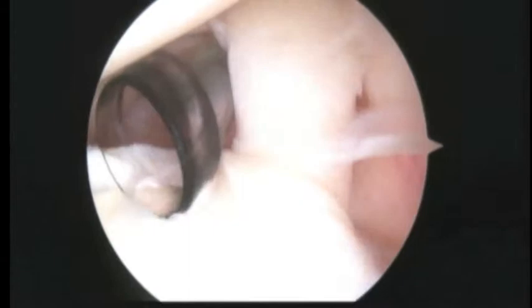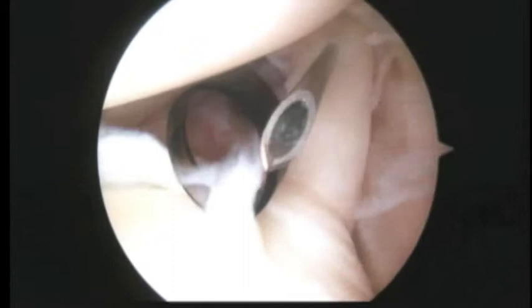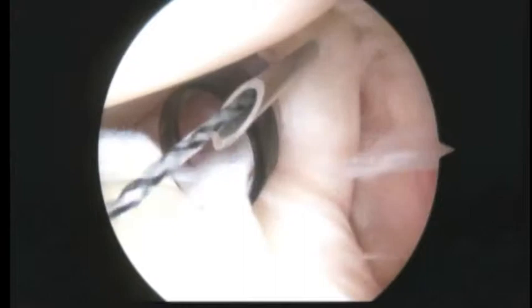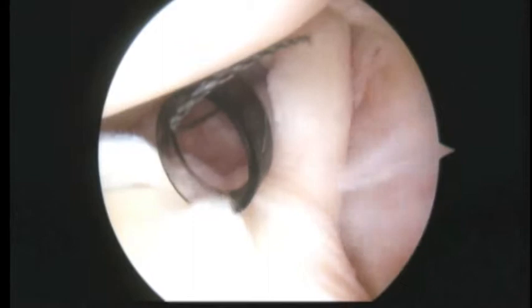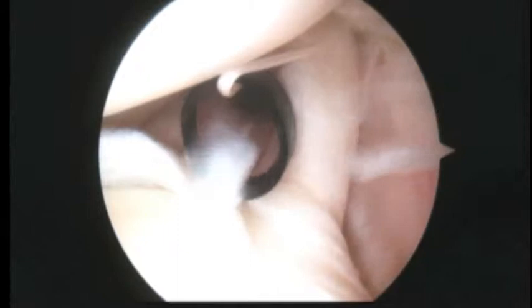Here we pass the needle right through the middle like that, we take a black wire called a super shuttle, pass that down, then we'll take a grasper. Then outside your shoulder we'll go ahead and load this wire with the white suture. That's the first step.